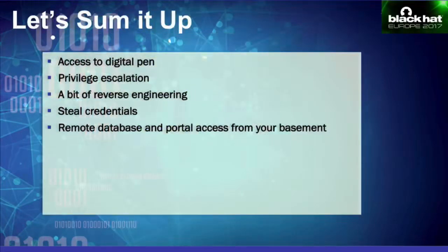To sum it up quickly, we got access to a digital pen. They're really tiny, and hospitals allow people to freely walk in, unlike corporations. So they are usually just exposed on the nurse's desk. If someone wanted, they could just pocket one, because it doesn't have to be connected to that whole setup to exploit this vulnerability. Then a bit of reverse engineering would allow you to decrypt that configuration file, which gives you access to the database, and then all the data could be accessed remotely.